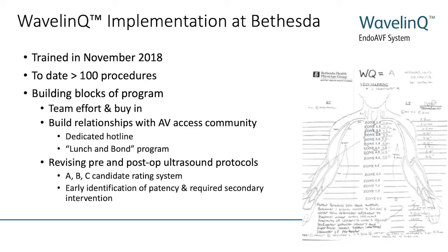And that clearly defines exactly what we're going to do, whether our venous approach is going to be proximal from the upper arm, our distal antegrade, whether the arterial anatomy is standard or whether it's a high bifurcation, where we believe that the creation zone should be, so that the efficiency and the focus of the team is not on what are we going to do, but it's just moving through the steps of creating the WavelinQ AV fistula.